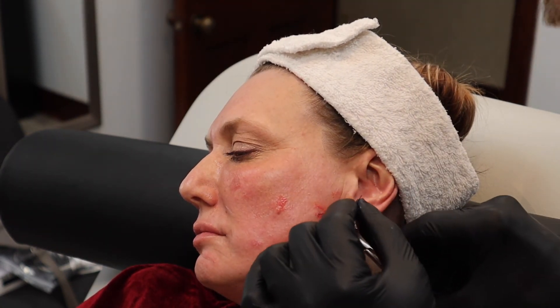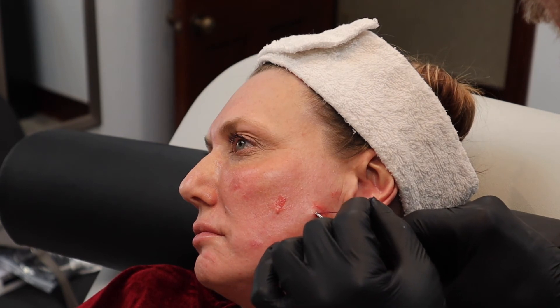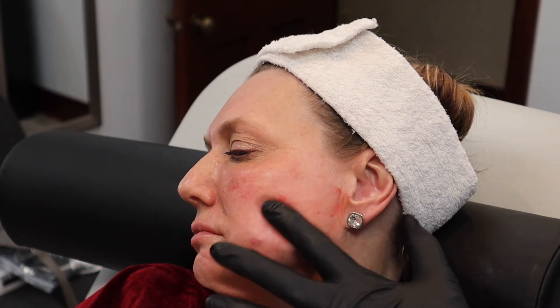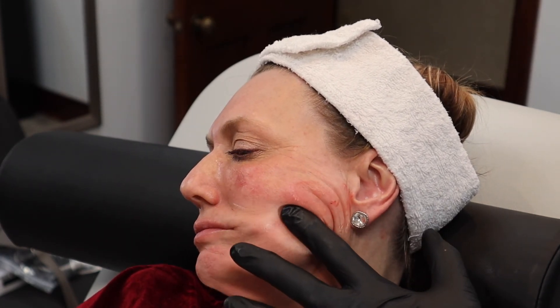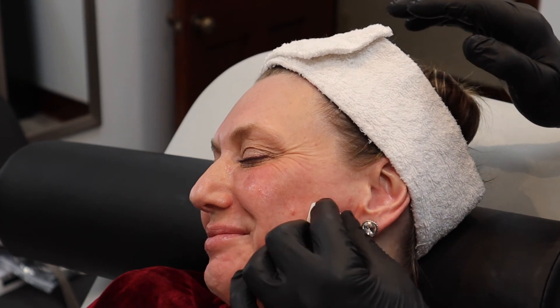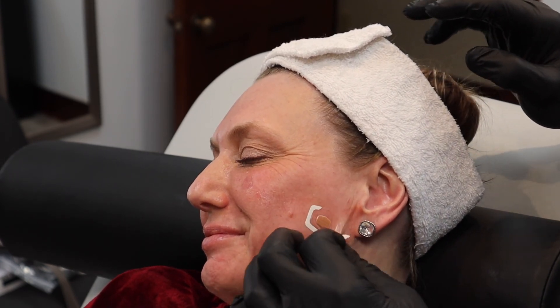Cut the thread flush with the skin, then pull a couple more times to tuck the thread in place. It's not sewn in place at all — the barbs simply hold it there. And here you've got a nice result. We put one of these little clear Nexcare waterproof bandages on there and have them leave it at least overnight, or replace it if it gets dirty.